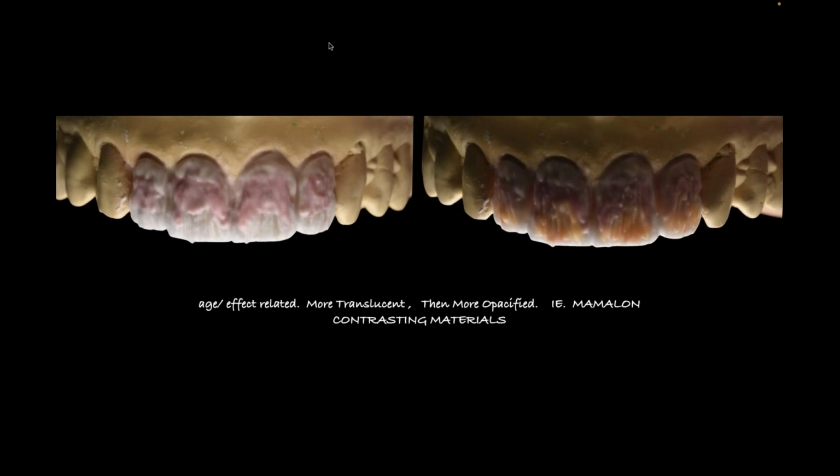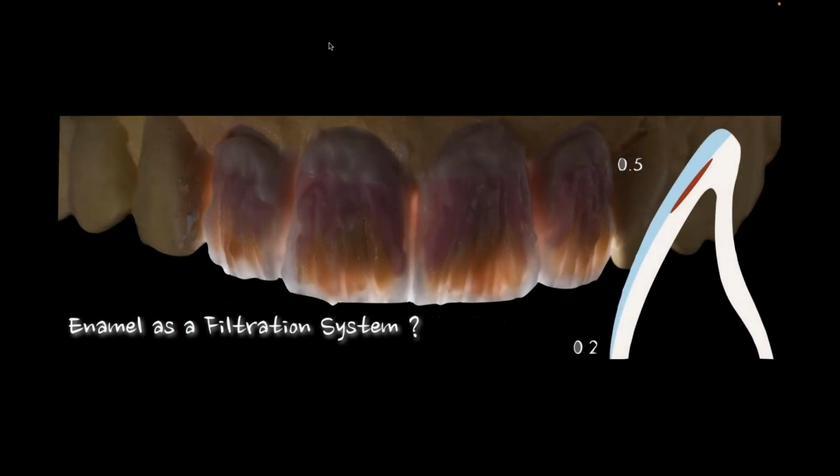So once I have my canvas complete and I have my mamelon set, now my goal is, how do I filter this? What do I want the light to do? Remember where we started. If I put something very translucent there, that means everything that is on that canvas that you see is going to be very frontal. It's going to be very facial, meaning that the light's going to go right through my translucency or transparency, hit what's there, and the tooth may appear either low in value or possibly slightly dead. Why? Because all the light is going right into that dentin and enamel, and it doesn't have any ability to refract or reflect or kind of make itself do what nature does.